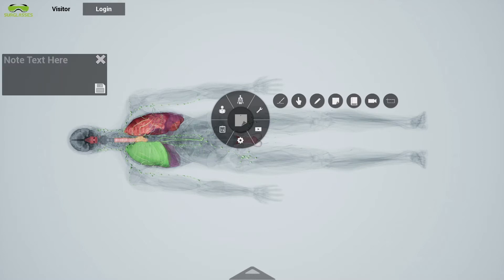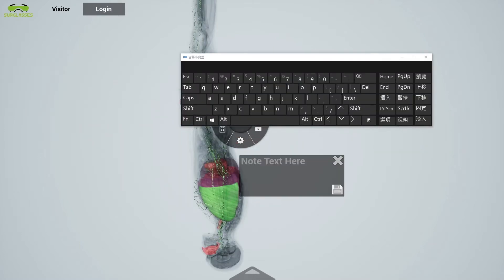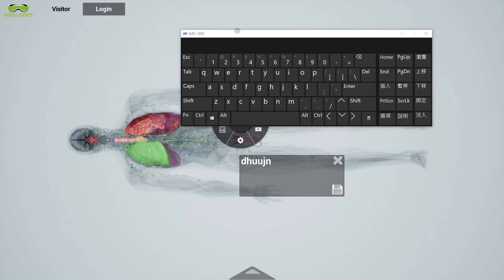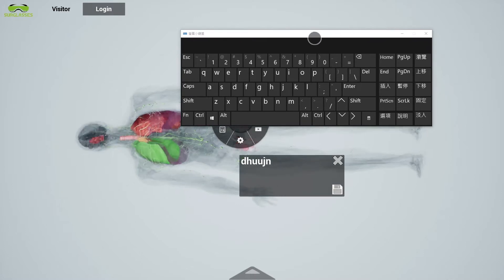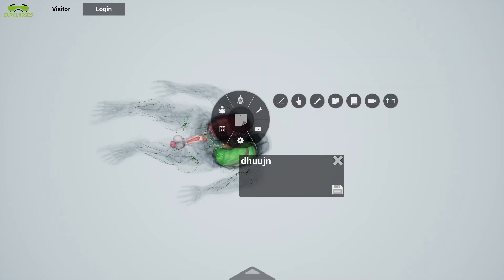Another feature allows professors to make their own annotations about the body part and take a screenshot or record a full video of the screen to share with classes later.